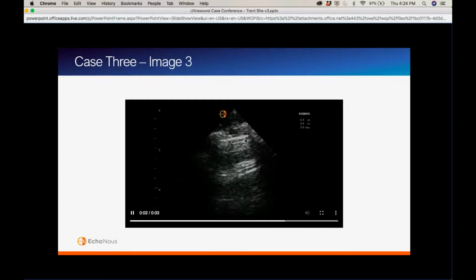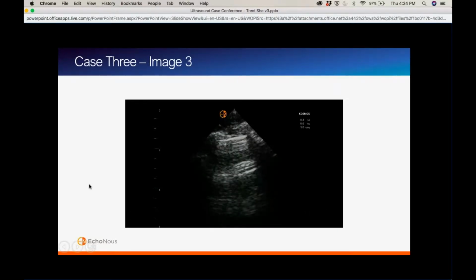I mean, this is really tough. Yeah, I think the tips that you had mentioned before, we could have done a couple things differently with this clip. First off, it ended up being really tough to tell, but decreasing our depth so that we get the pleural line in the center of the structure, and turning our gain down so we could see pleural sliding. Even then, to me, it looked like minimal to no motion on this, and it was a hard call. And I think this brings up another beautiful part of bedside ultrasound, in that you have your patient there and you can make other assessments.